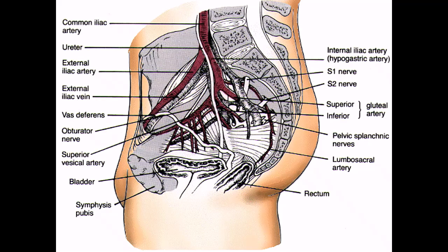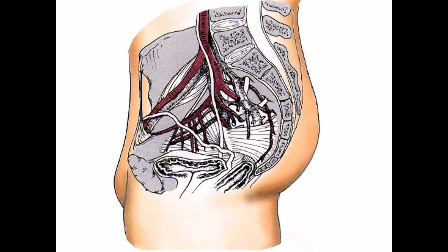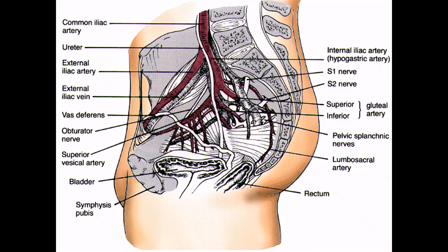You don't need to be playing with trying to get a lateral C-spine on a stabilized patient when they have a pelvic fracture and they might bleed out.